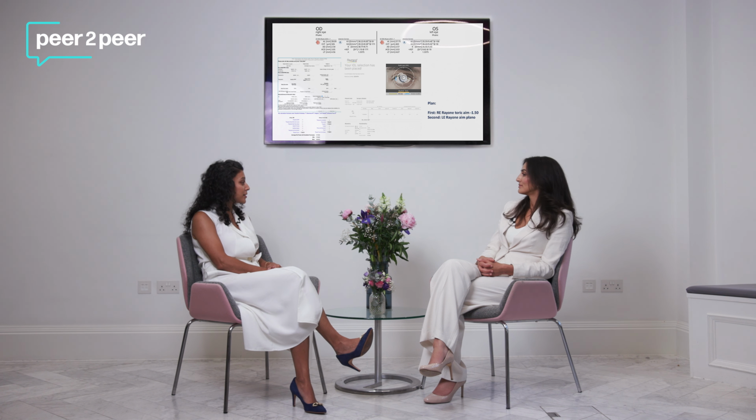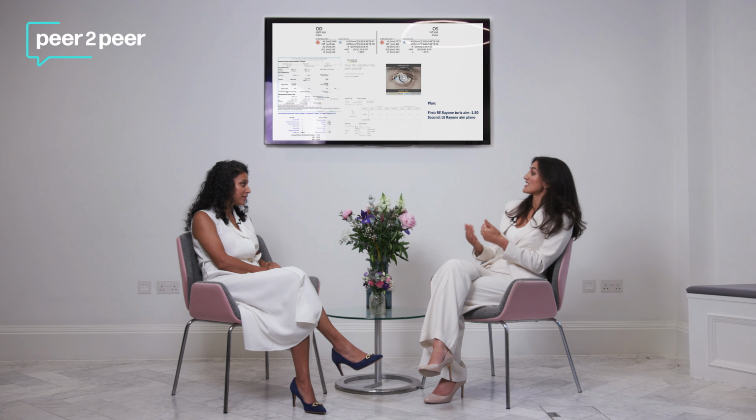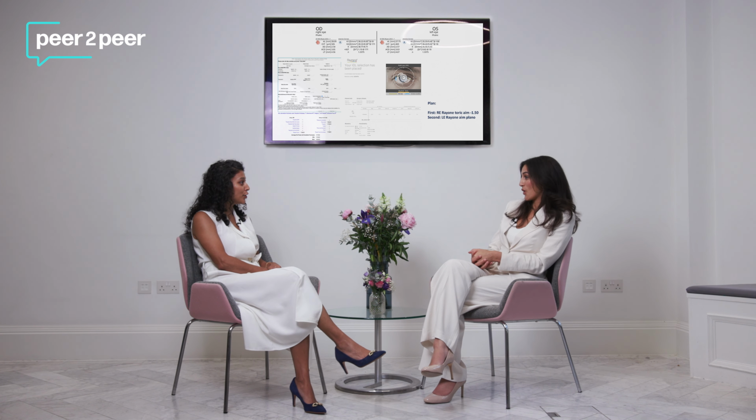Now, this patient had some astigmatism on the biometry in that right eye, so we then had to input that spherical equivalent that we were after into the RayOne IOL calculator to come up with the toric lens that you needed. So once you know the spherical equivalent that you want, you have to input that into the calculator. Exactly. So you will have to fudge your refraction essentially to get the spherical equivalent that you want. You do. It does have a functionality where you can just manually input the SE that you require and you add it in. It will do the calculation based on the SE that you have inputted, and you ignore what the post-op would be because you know that that's the spherical equivalent that you require.